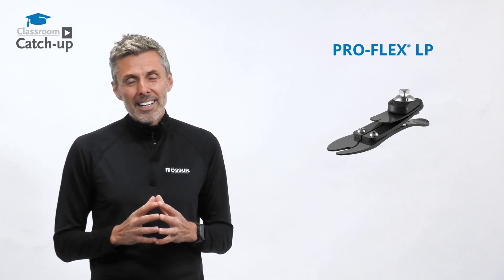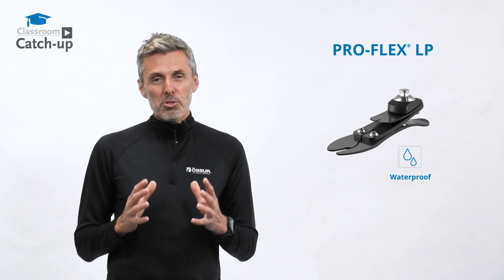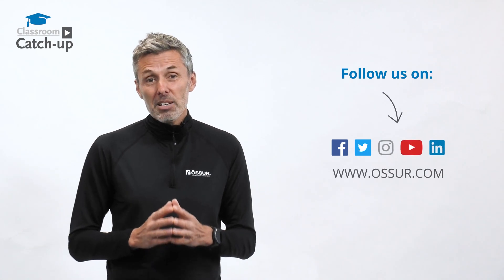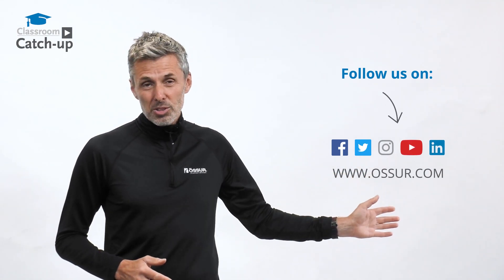The Proflex LP is a waterproof, high-performance solution for many users with longer residual limbs. For more information on this and any of our other products, please contact us on our usual channels.